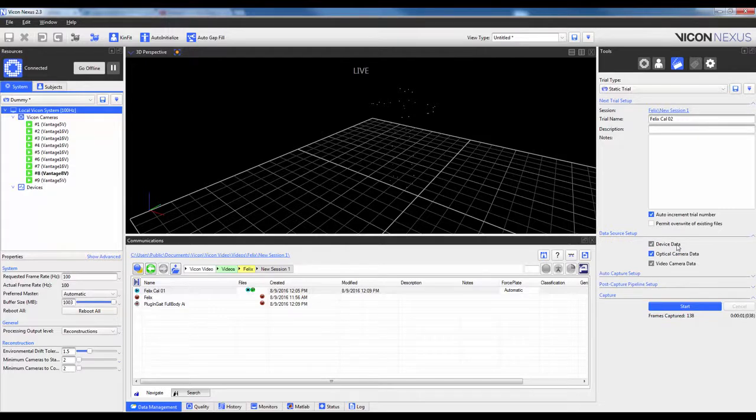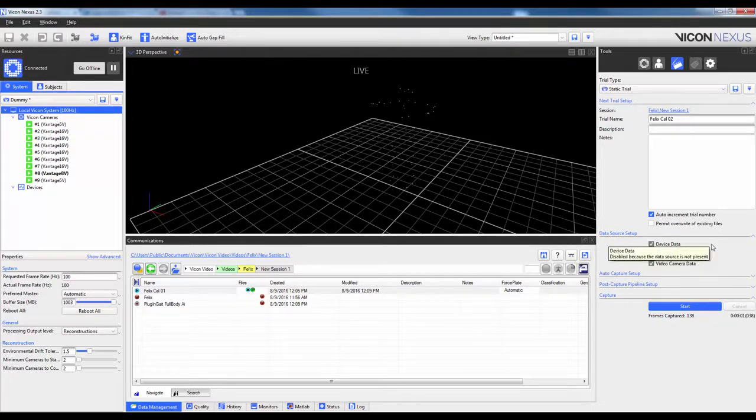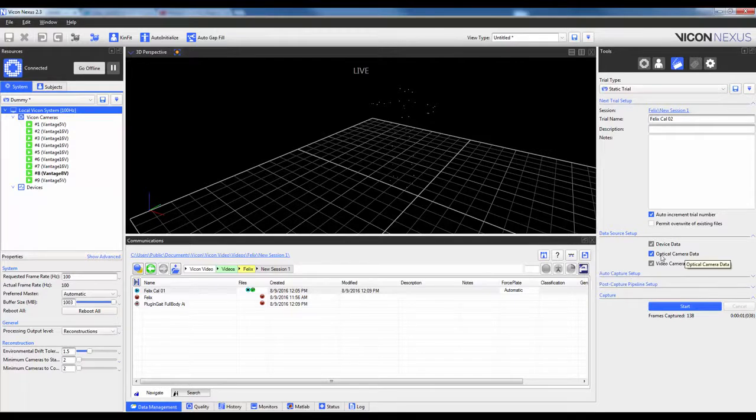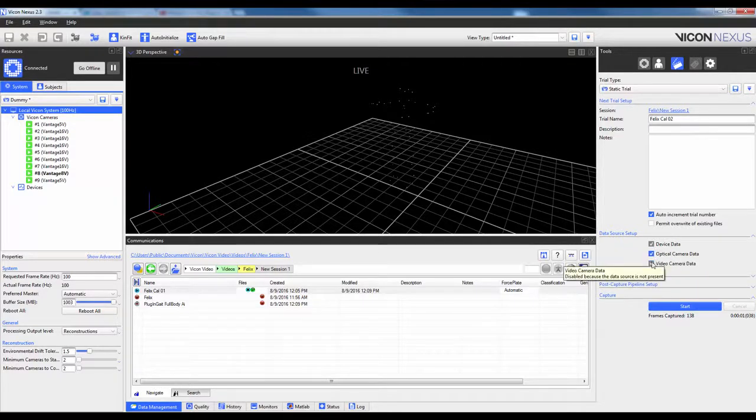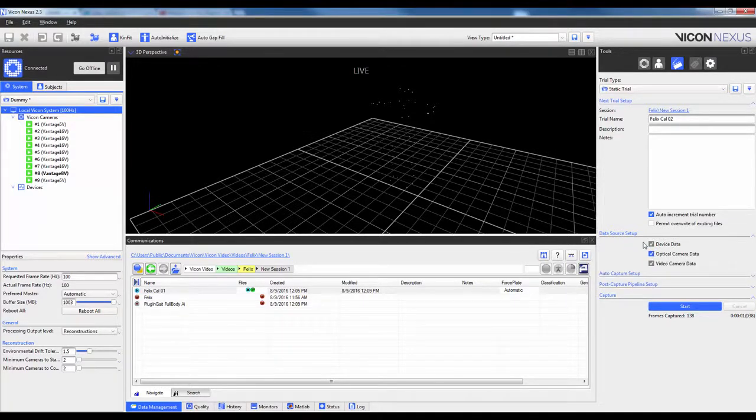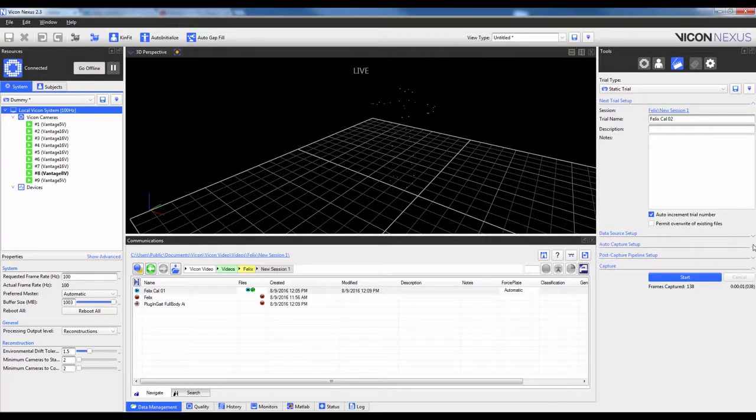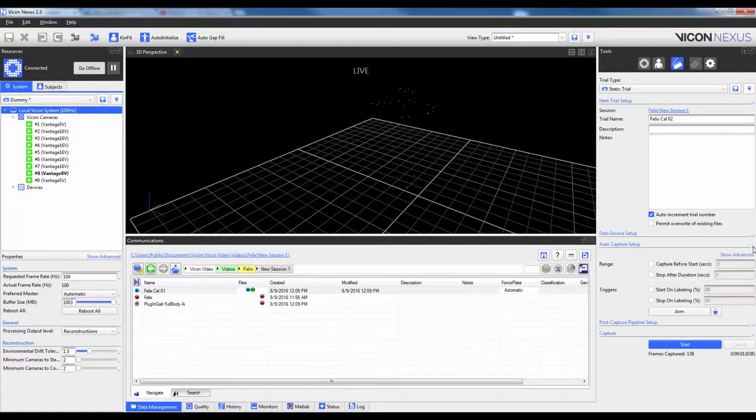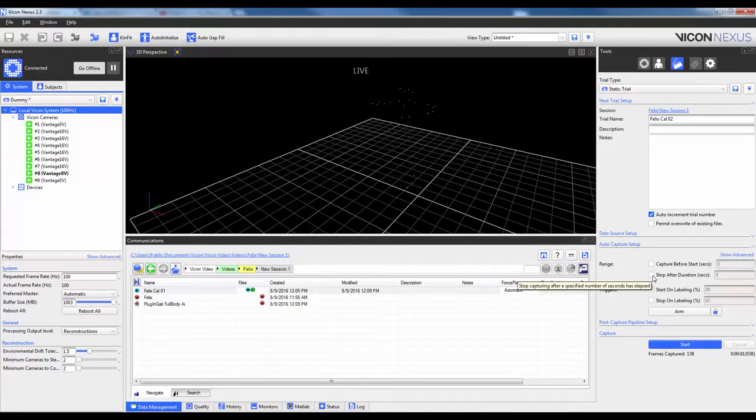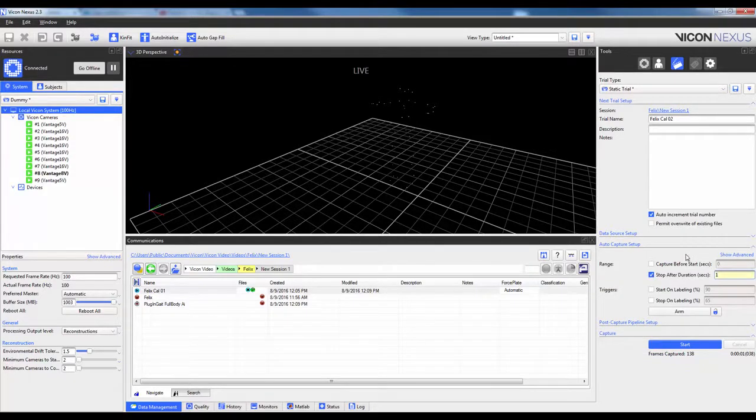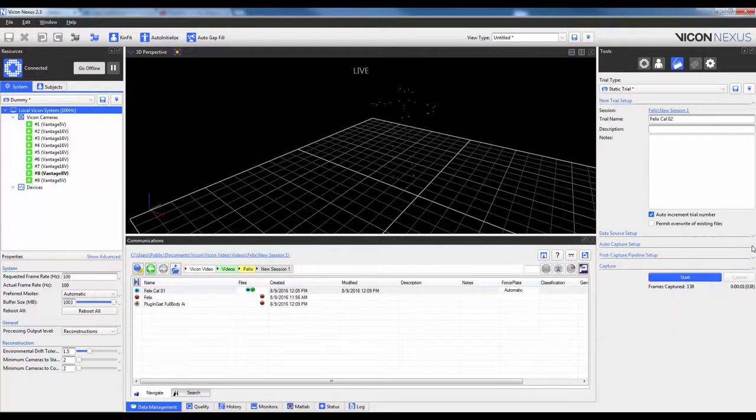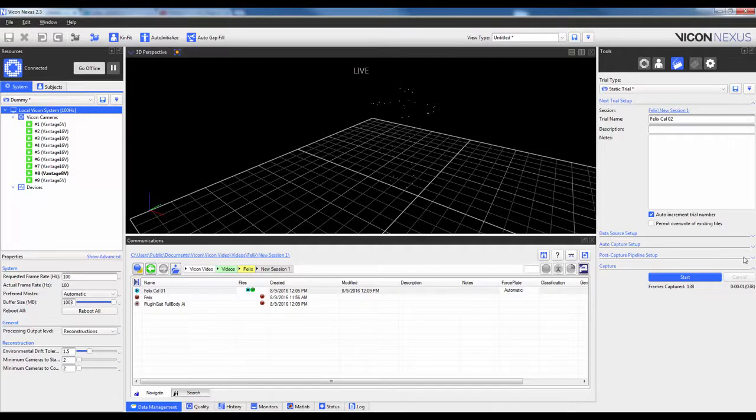So now I have the options of selecting whether or not I want any force plate data, EMG, or video camera data. In this case, I only have optical, so that's the only one selected, but I can deselect them should these actually be in my system file. As I only really need one second of data, I'm going to go ahead and tell it to stop after the duration of one.